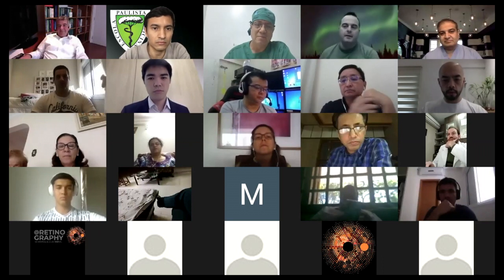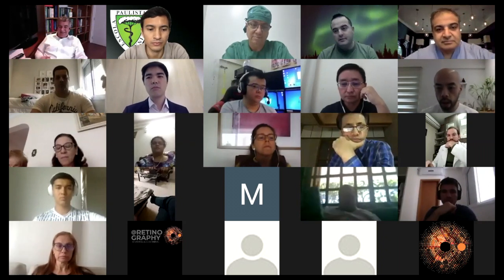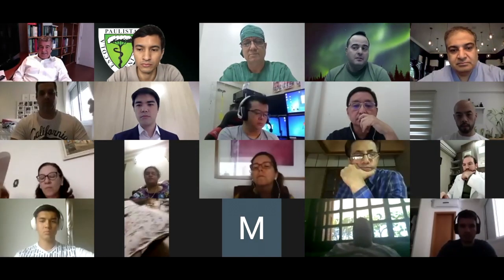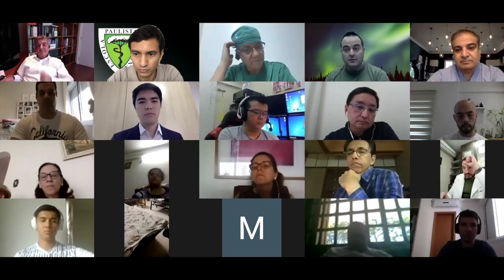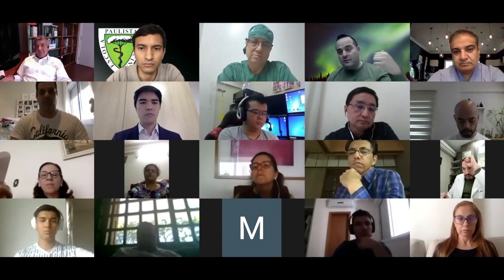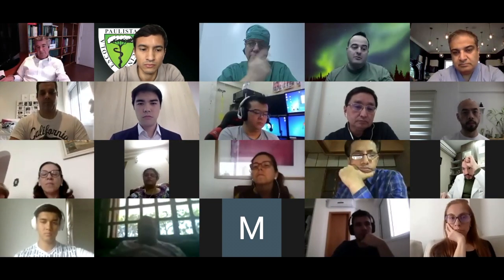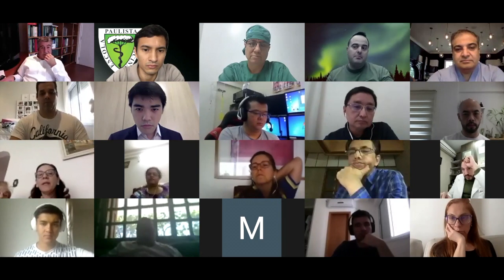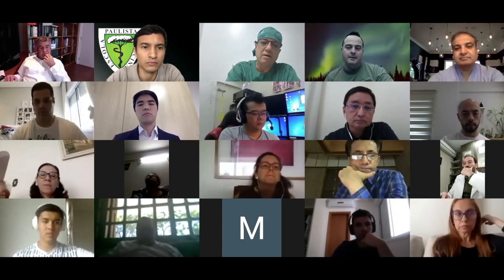Thank you. If I can comment, I think that the technique is wonderful and is applicable to every surgeon as long as the hydrodissection is sufficient and well done. Another thing to note is the hydro implantation of the lens. I also use that technique and I completely agree. The next day you don't have refractive surprises, or fewer of them. You don't have raised IOP and the cornea is clear. You also turn over less fluid in the eye because you skip the step of evacuating the visco. So beautiful surgery. Thank you, Dr. Neto. Thank you.